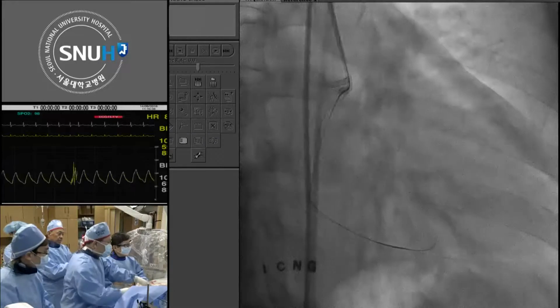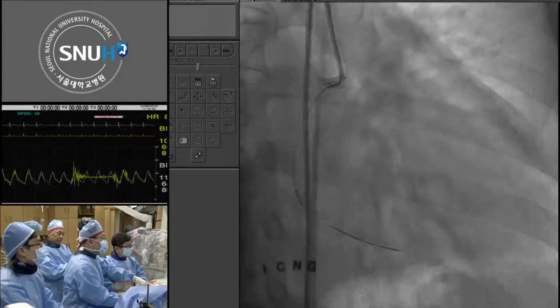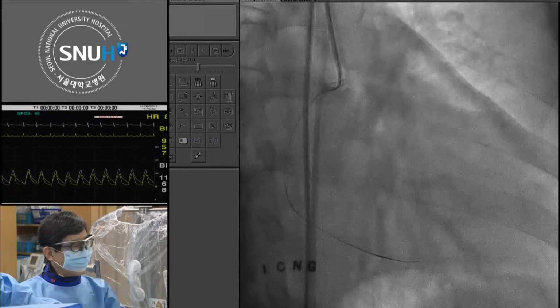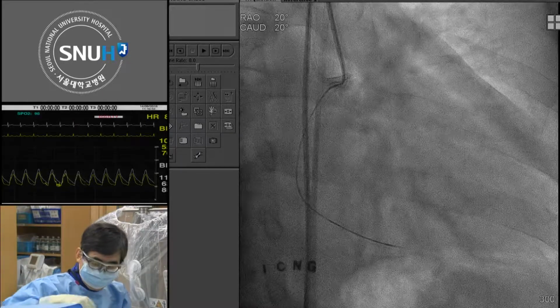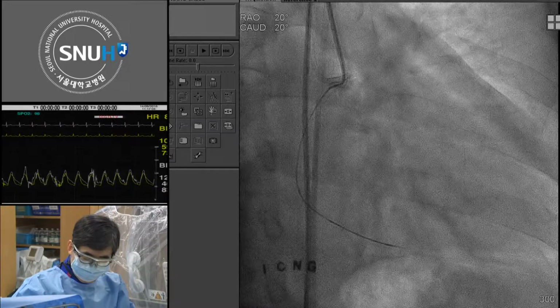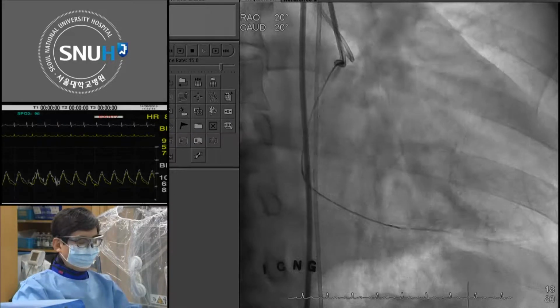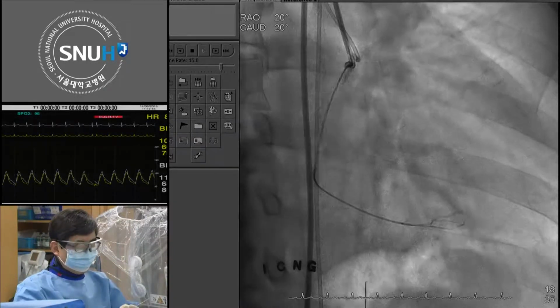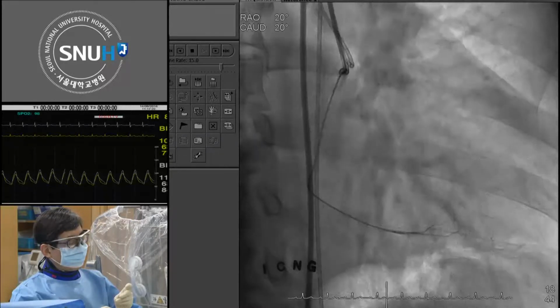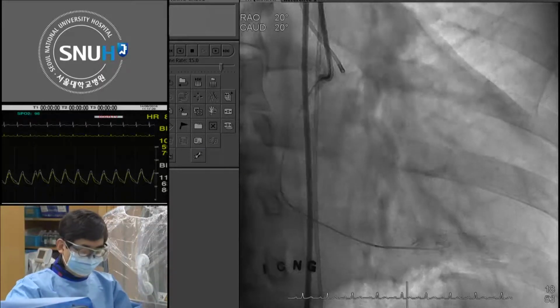So I think it depends on the operator's experience. Dr. Kim, when was the last time you failed the antegrade approach? I mean, the young doctor. How long has it been? Two weeks ago. Okay, so it's too early maybe for retrying the antegrade approach at this point then. I agree. That is another factor in why I do retrograde first. Yes, we already discussed that retrograde is okay.